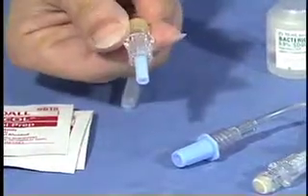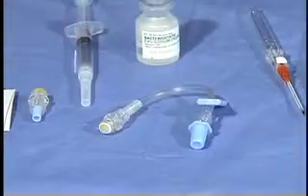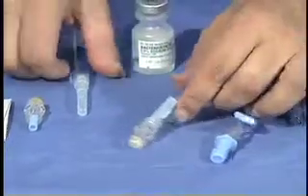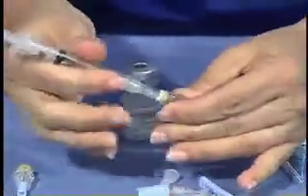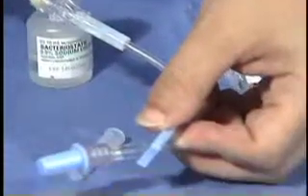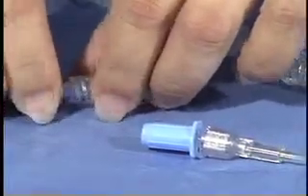An IV plug can be used to close the system after the catheter is in place by securing it to the end of the catheter. Extension tubing may be desired and should be flushed prior to securing it into the catheter after placement. IV tubing flushed with the proper IV solution may be directly secured into the catheter. All caps should be loosened prior to catheter insertion.